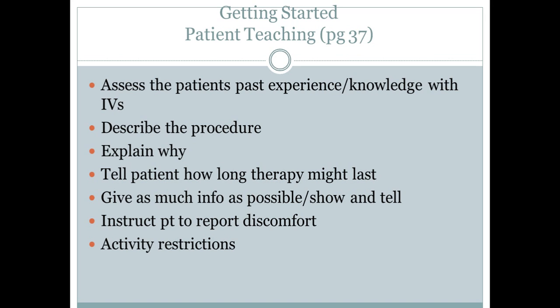I have seen people put an actual glove over the site. The gloves that we use, I'll see them do that. There are actual little plastic sack things that are specifically for covering IV sites, and I've seen people tape those. So just some things that you might want to think about.